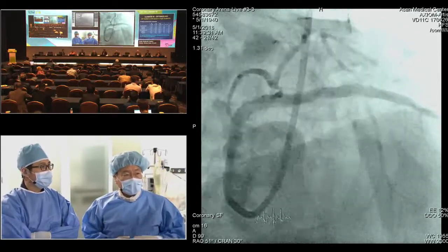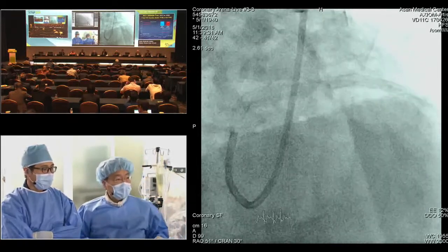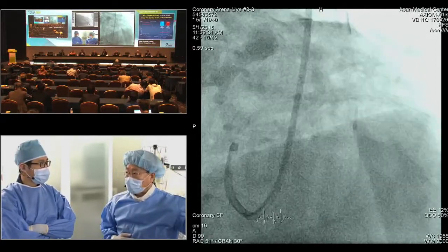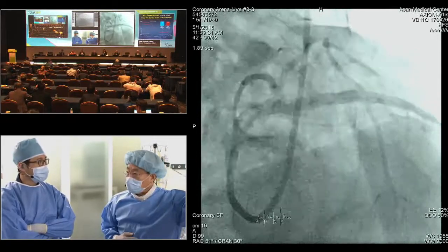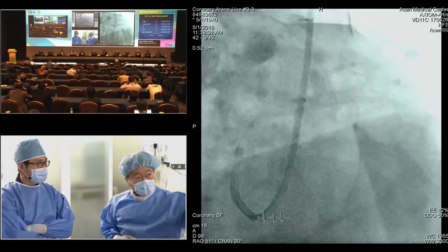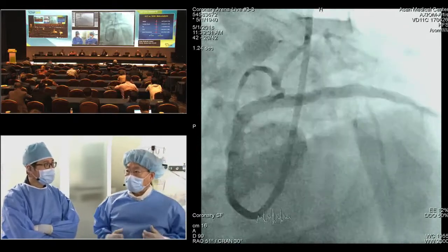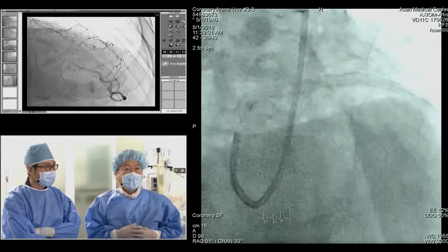In total, at the beginning we didn't expect this one. So, all right, from now on we're going to do IVUS again, and I think 3.75 high pressure, non-compliant inflation, on the mid portion especially. We have already lost the diagonal branches, so don't care about that one. 3.7 high pressure, 4.5, and up to 5 something, right? We can get a more effective scenario, right?